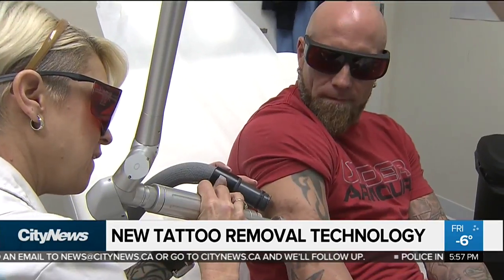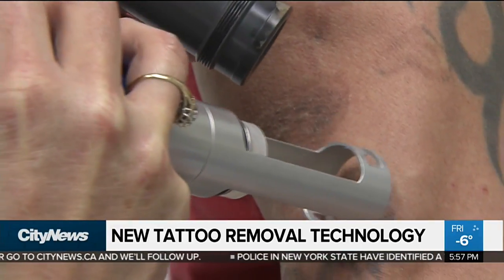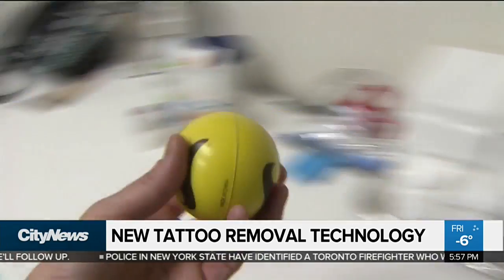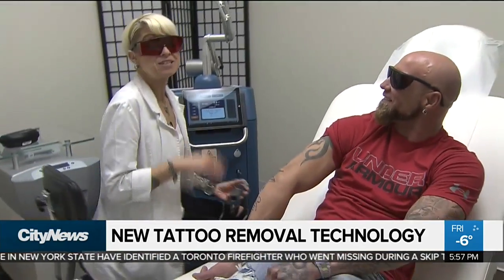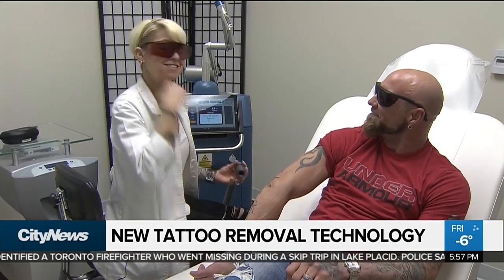But while it may be a new treatment, unfortunately it's still the same old pain — and a lot of it. Which one do you like? The purple one lights up when you squish it. People like to have that stress ball just to get through the pain? Yes, a lot of my patients do ask for the stress ball — just to grab it generally and get through it.